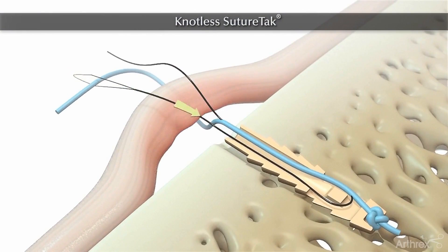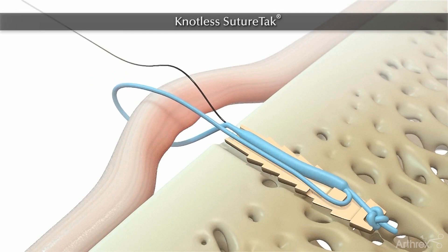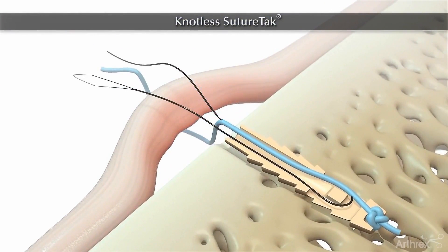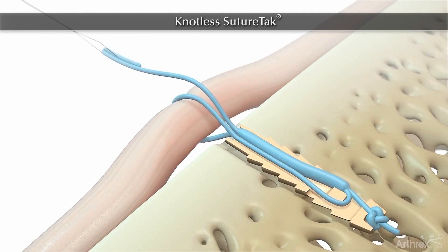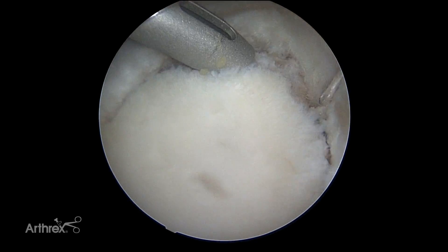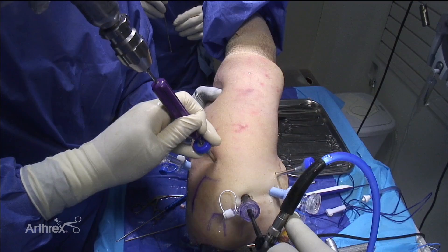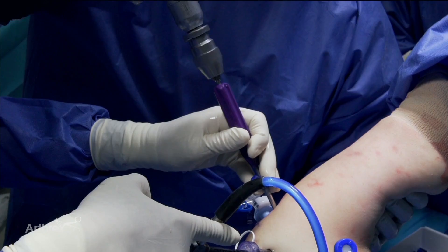The anchor has a nitinol threader that comes through the body of the anchor and pulls the suture through the sheath. It's a tightrope technology — essentially a suture core through the sheath — that works like a Chinese finger trap for tensioning, and it won't pull back on itself. So it's a no-slip knotless loop. Now let's drill this — you can get all the way down to a six o'clock position, which is another reason to take a little cartilage off to have a two millimeter track of bare bone to aim at.